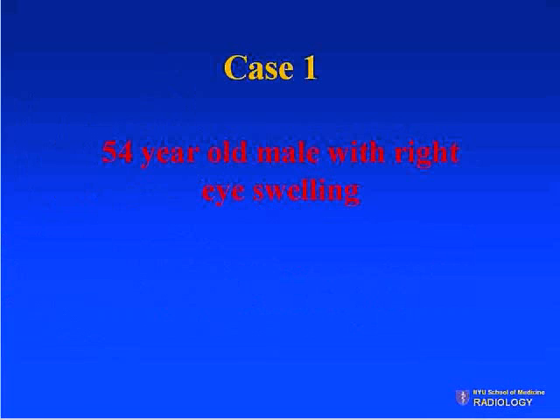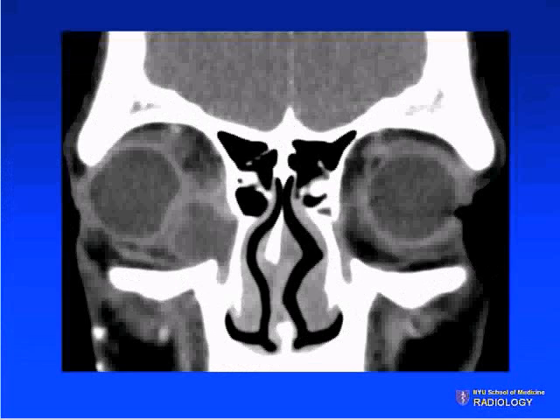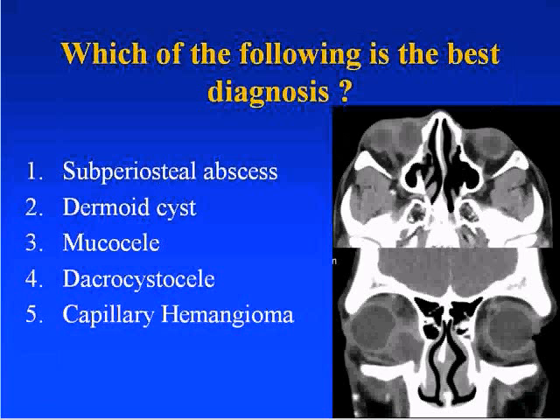The first case is a 54-year-old male with right eye swelling. Two images from a CT scan — a coronal image. Which of the following is the best diagnosis? Number one, a subperiosteal abscess; number two, a dermoid cyst; number three, a mucocele; number four, a dacrocystocele; and number five, a capillary hemangioma.